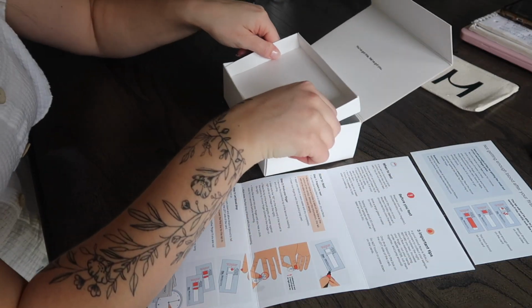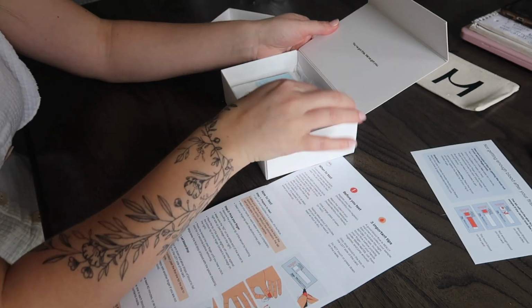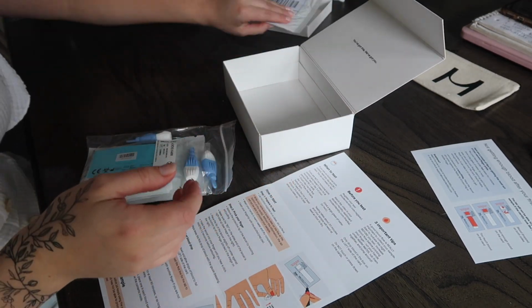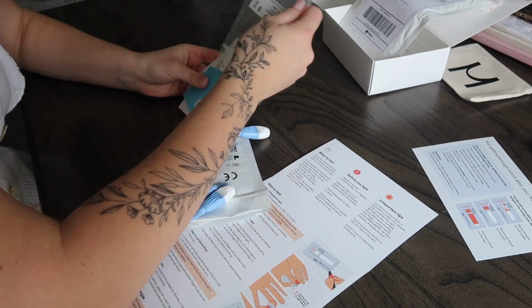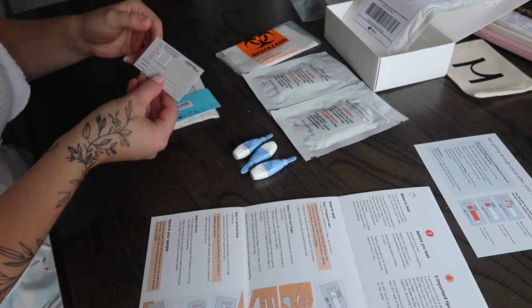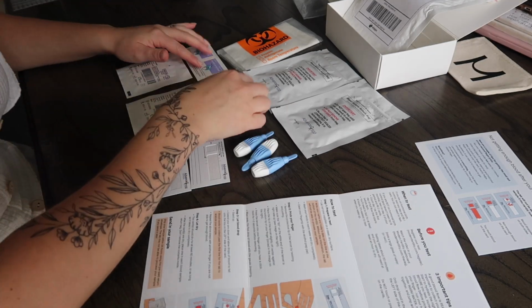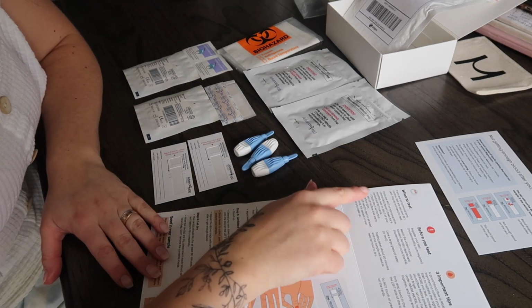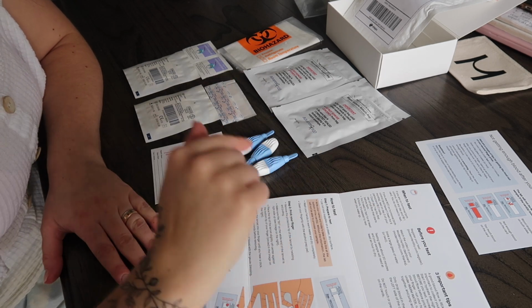I'm going to move you down to the table so you can see exactly what I'm going to do. I'm going to go from there. So I am not on hormonal birth control and haven't been for 9 months, so I'm going to test on day 3 of my period, which I am today.